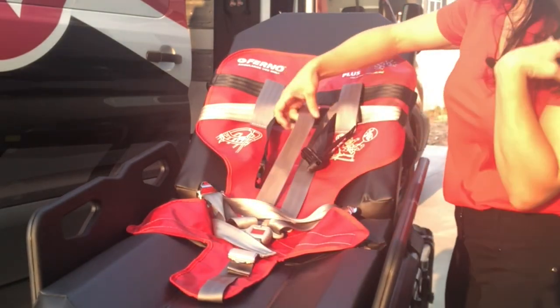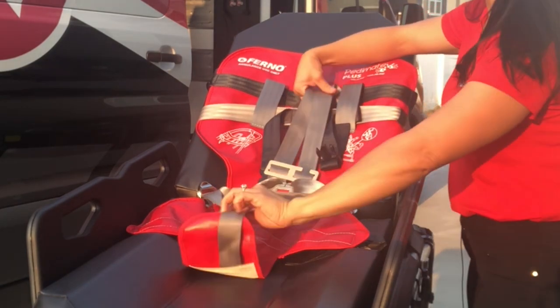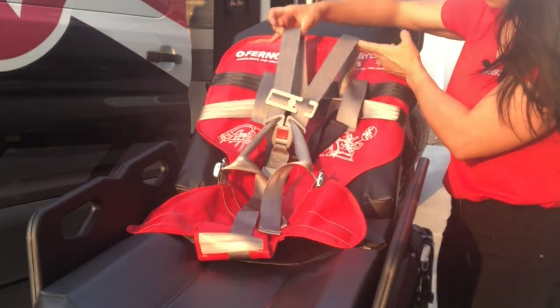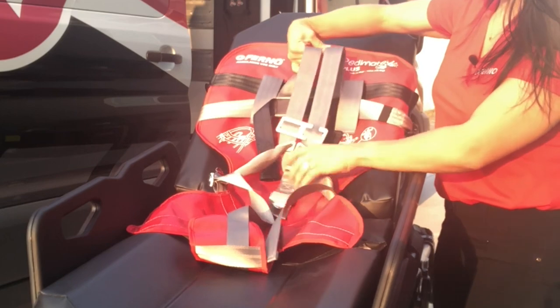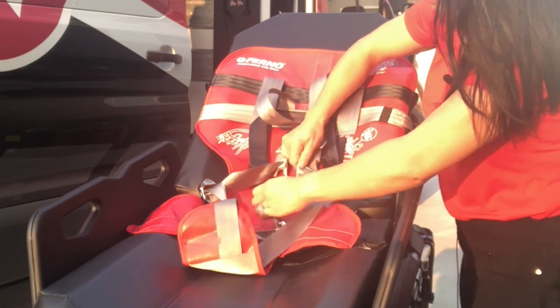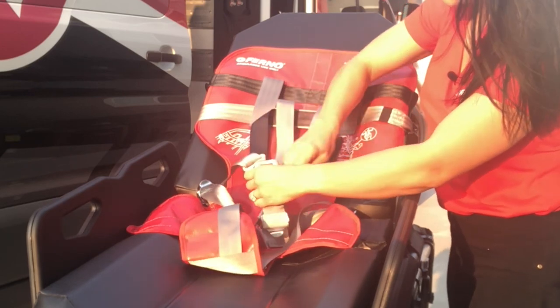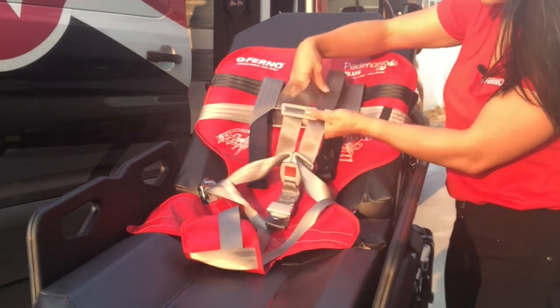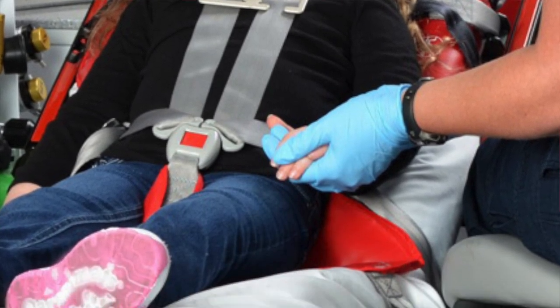Now you're going to notice your other straps here. I like to compare this to a child's car seat — that's the best way to describe the harness setup that we have here. You're going to have the shoulder straps, which go over the shoulders of the child. This here is your buckling system — go ahead and secure that right into place. You can adjust this piece, and the recommended placement is right below the clavicle.